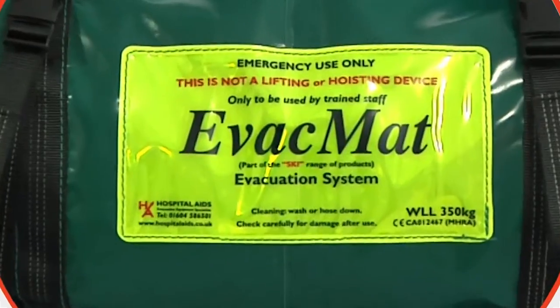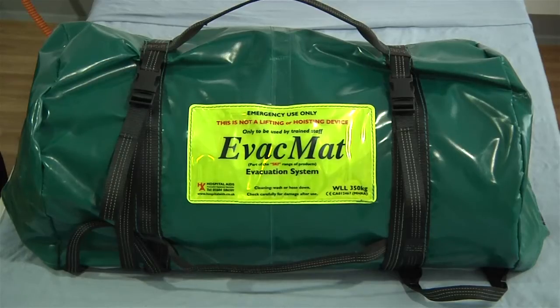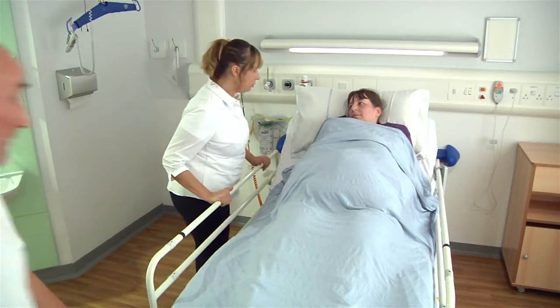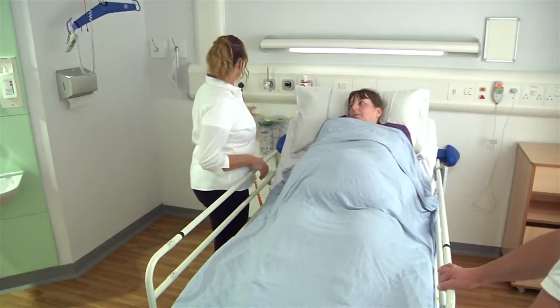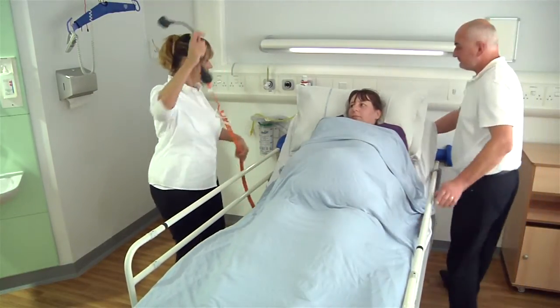In an emergency, the evac mat can be carried to the evacuation location by the carry handles. In some instances, the mat is located with the bariatric bed at all times. To reduce the physical effort of the carers, moving the patient as close to the exit or stairs as possible on their bed is strongly recommended if space allows.